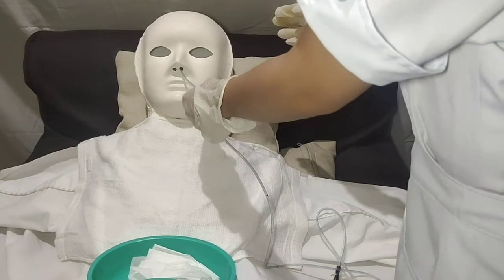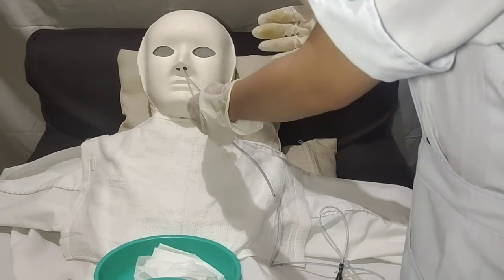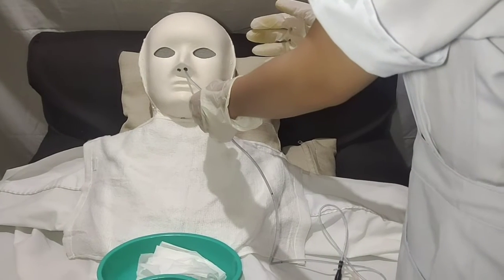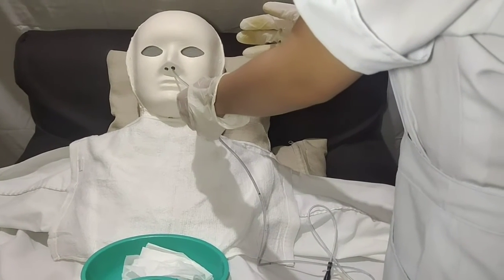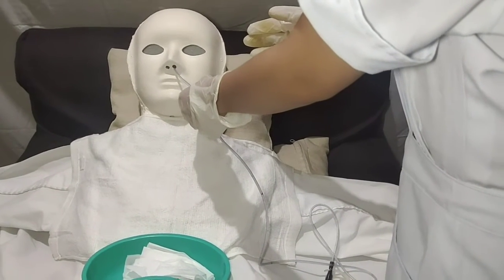When pharynx is reached, instruct the patient to touch chin to chest, encourage the patient to sip water through a straw or swallow even if no fluids are permitted. Advance tube in downward and backward directions when patient swallows.